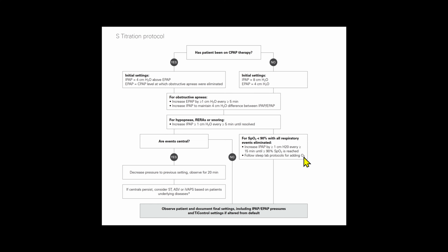The takeaway here is that you can basically replace every X minutes with every night and do this yourself. Now, I'm not a doctor, blah, blah, blah, disclaimer, but these are the clinician guidelines provided by ResMed. I realize this is probably becoming insufferable at this point, but let me repeat the crucial principle which I'm always trying to impart on you, which is these are generalized guidelines. You're an individual. Medicine should be patient-specific and tailored.